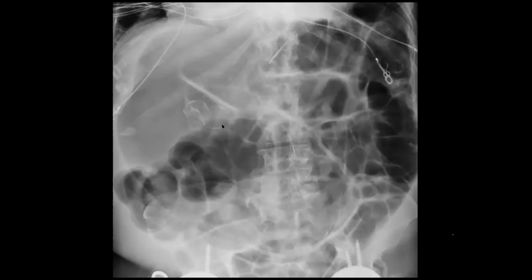Good. What does that mean to you when they're rim ovoid? Are they related to the gallbladder? Yeah, I was thinking these could be gallstones, but they're kind of huge. And is this whole thing the gallbladder, that whole shape? Or a liver lesion with calcifications? Is that weird? No, that's a good thought.